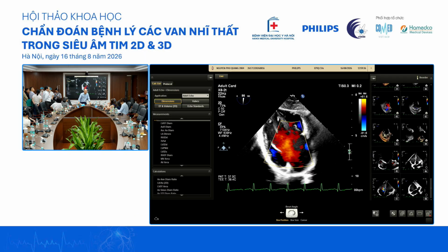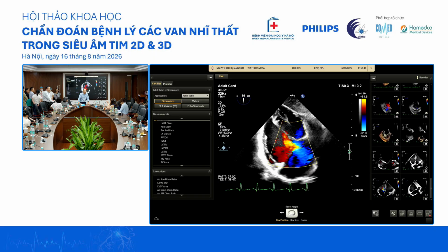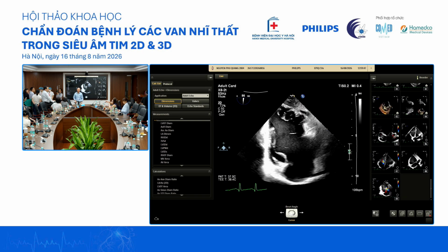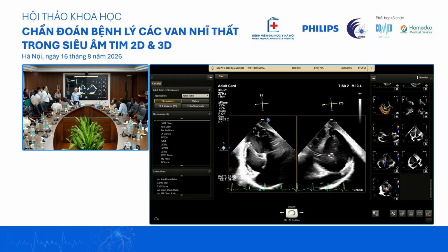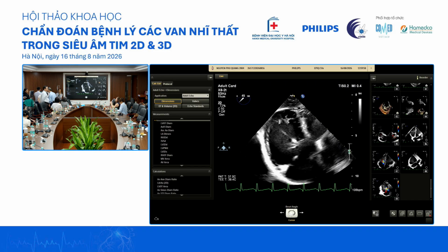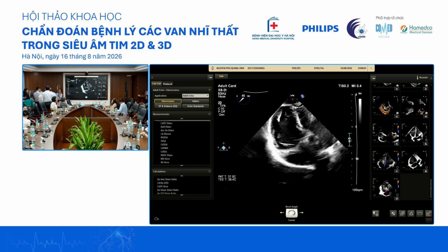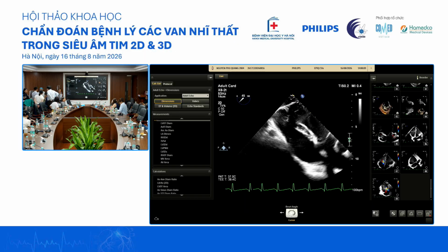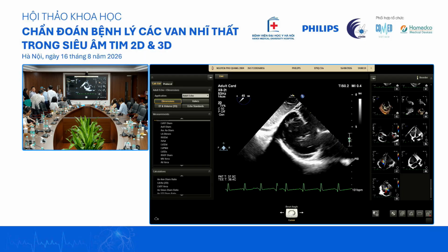Atrial septum? Oh, they say they look for shunt, but only on echo, not on transesophageal. Oh, you want to shoot the bubble? No, just angle and put color, because at a certain angle when he turns. It doesn't look fast. Bubble study? Yeah, I guess the last part is just to shoot the agitated saline contrast to rule out the shunt. You think you can do bubble study? We don't have a three-way. It's okay. Maybe at least just put on the color flow over the septum.